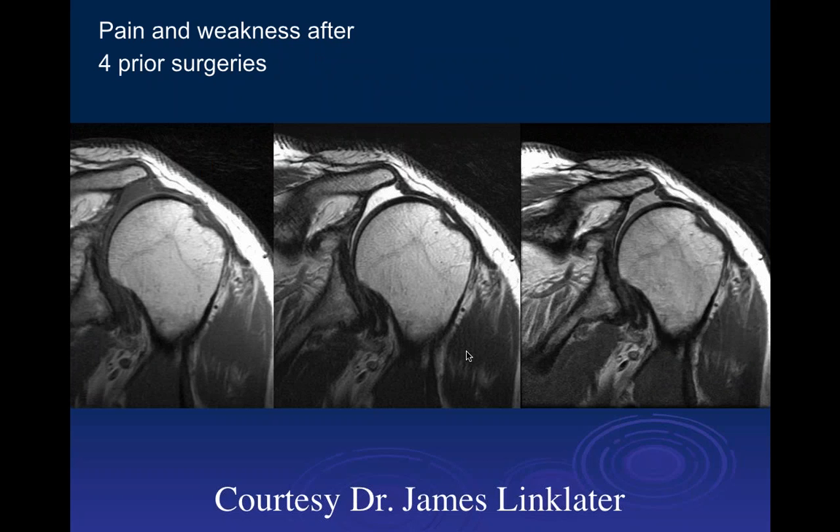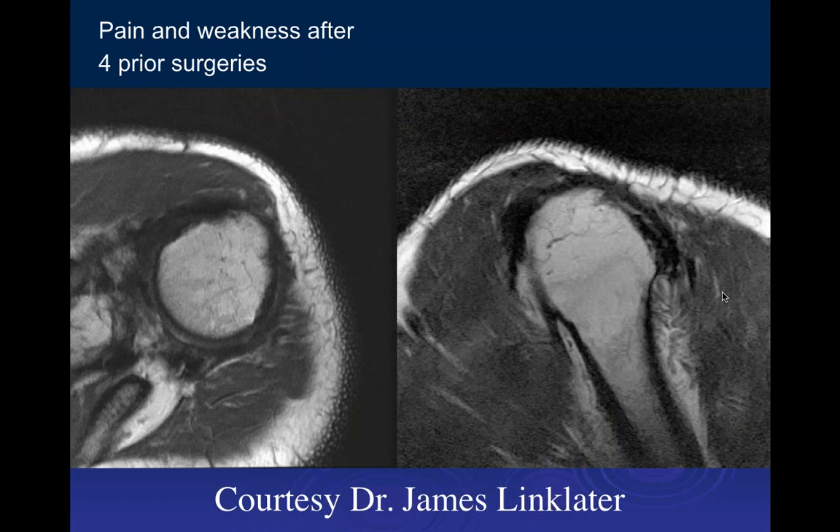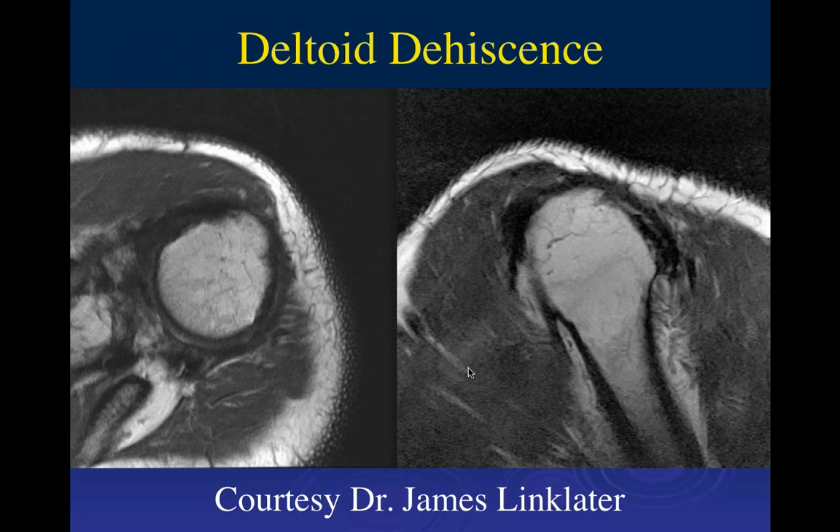The next case involves pain and weakness after four prior surgeries. On frontal images through the post-operative shoulder, the deltoid shows marked atrophy. The deltoid typically goes out to the acromion process, but here we see marked displacement of the deltoid origin, with only thin fibrous tissue where we should see deltoid muscle. On axial images there is a clear loss of the deltoid muscle throughout — this was a deltoid dehiscence, which is a major problem.